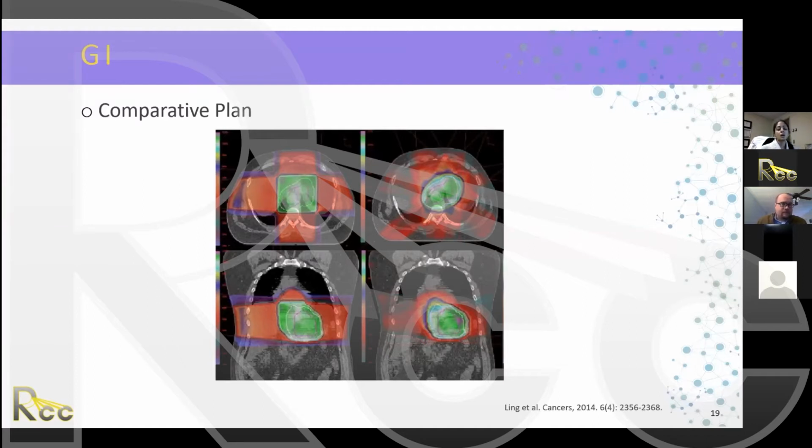Okay. So for esophageal cancer, usually all of my patients we treat with 6 MV. It depends on your machine capabilities, which energies you have available. My machine here is an Elekta machine where I'm at, and so we have 6 MV and 15 MV. And so I do VMAT for all my patients with 6 MV for esophageal cancer. And what was part 2 of the question?